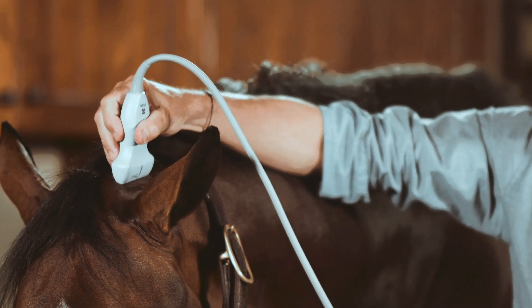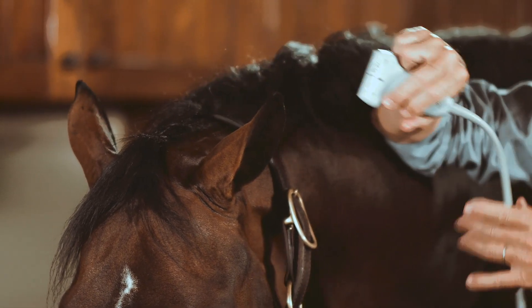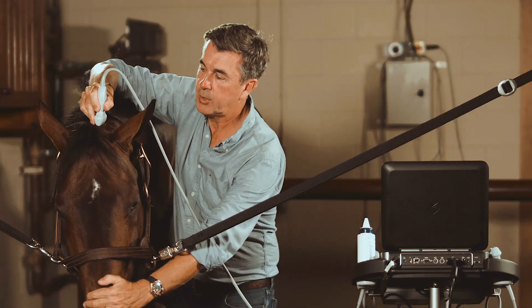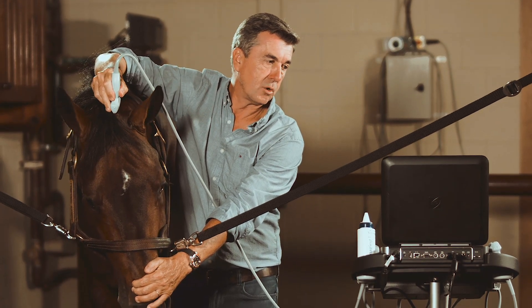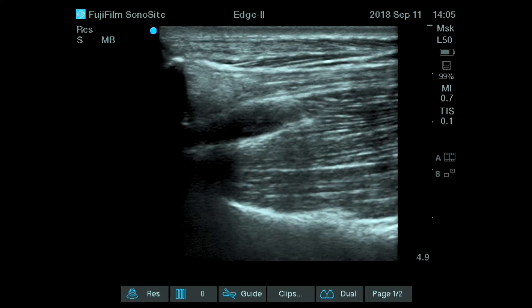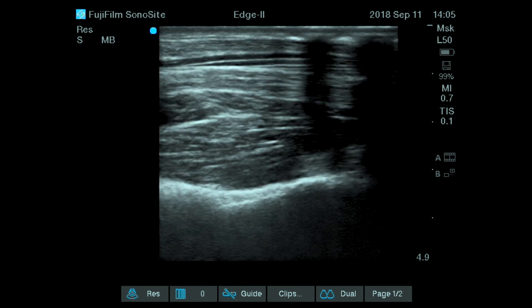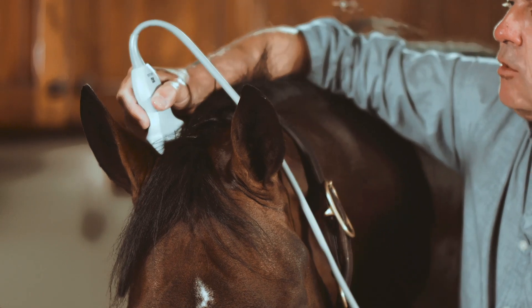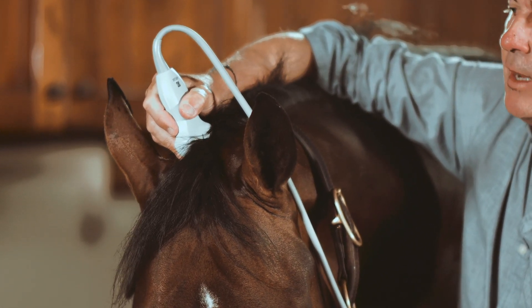This horse has been lightly sedated. We can put the probe directly on the proximal aspect of the crest. If you want to see the crest a bit better at the insertion of the semispinalis muscle and the nuchal ligament, we can push a little bit forward and get exactly in the mid-axis. You can fan your probe sideways to see different anatomical elements of this insertion and also go to the right side to check for any asymmetric finding.